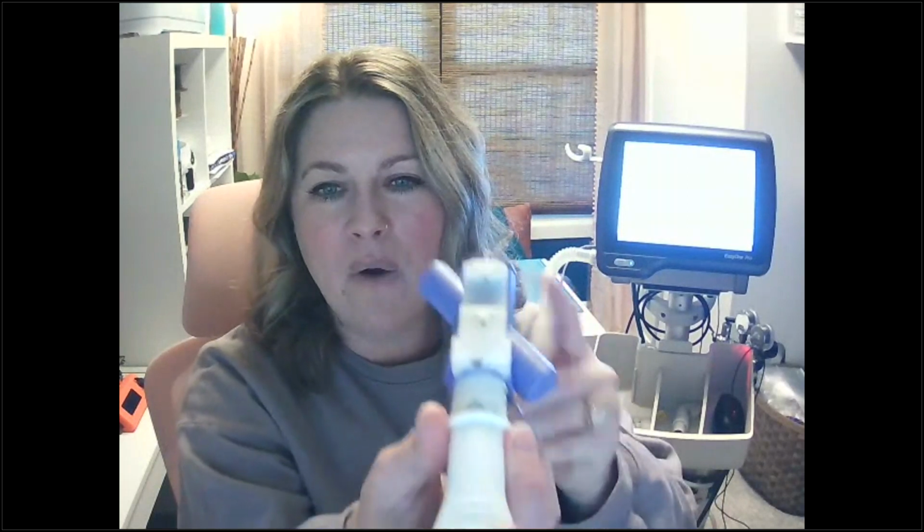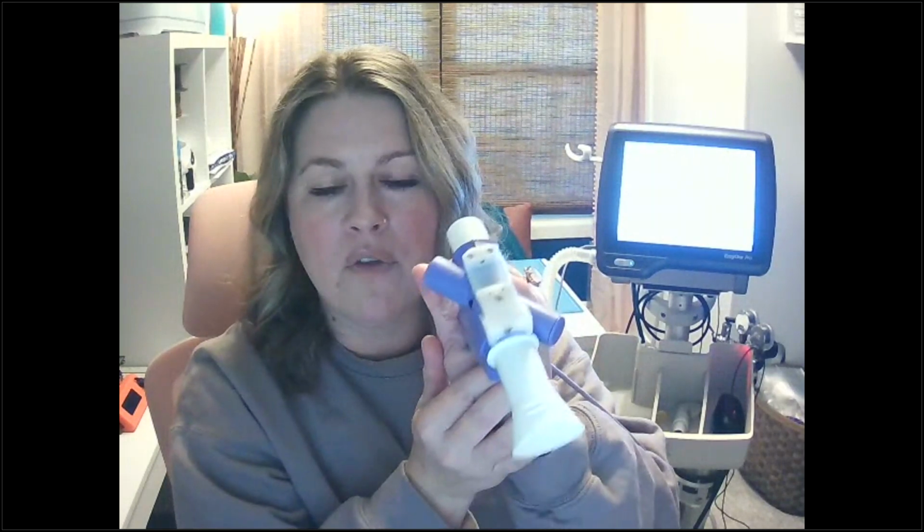So just like I showed you on the other mouthpiece, you'll see that I have colored all of these in after multiple years now of virtual training, but you'll want to make sure that the arrow on your mouthpiece is lined up with the arrow on your hand sensor. Make sure that it's pushed in all the way flush. If you happen to have it in upside down or not in far enough, it is going to give you an error that the spiret is inserted incorrectly.